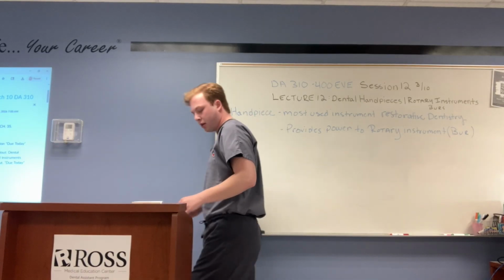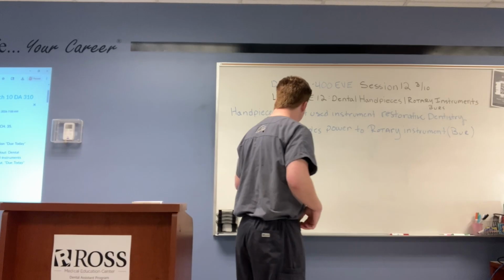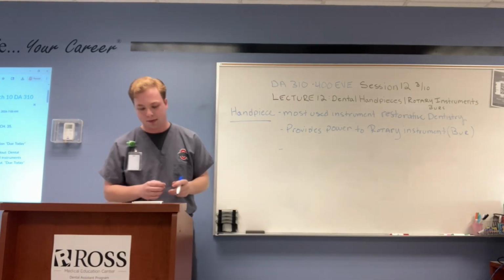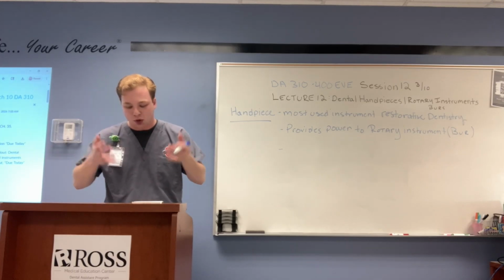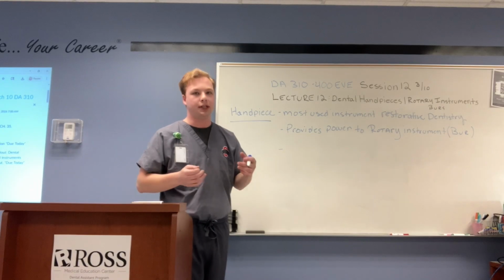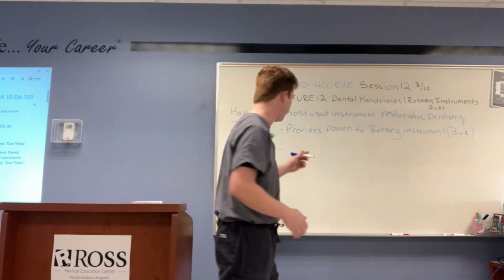So this is about the handpiece, right? And the final thing about the handpiece is exactly what Sabrina said, right? It does the actual cutting and polishing of the teeth. So this is the instrument that's used to actually cut or polish the teeth.